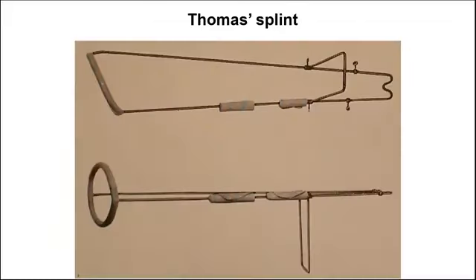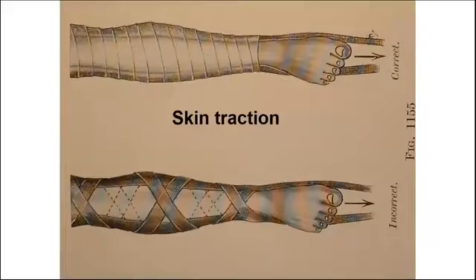Of course, this is a Thomas splint. I hope you do have this type of splints in your respective facilities. This is still a very important non-operative tool, either for temporary or for definitive treatment where applicable.